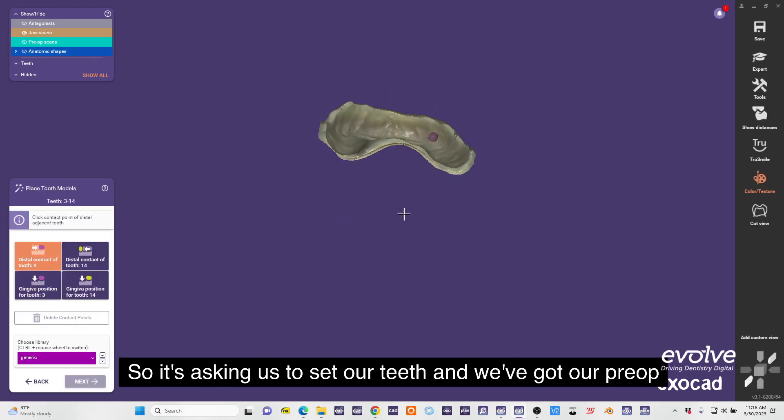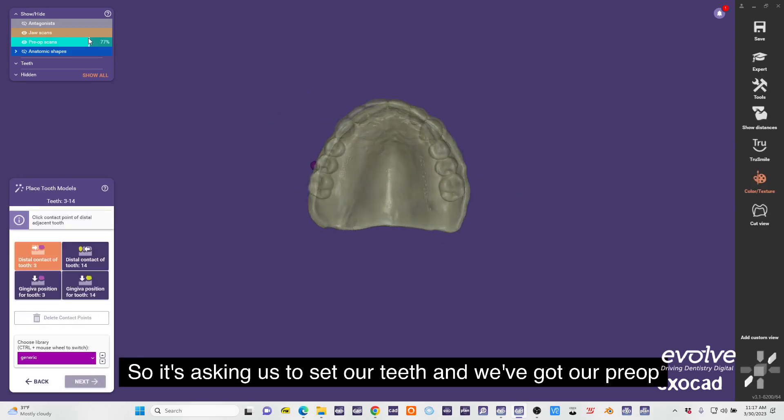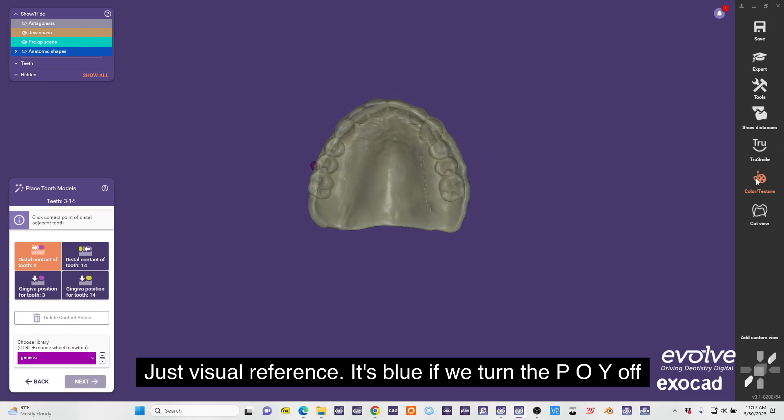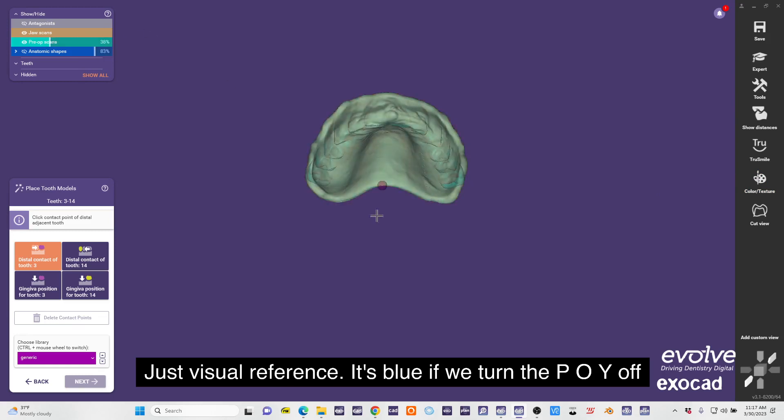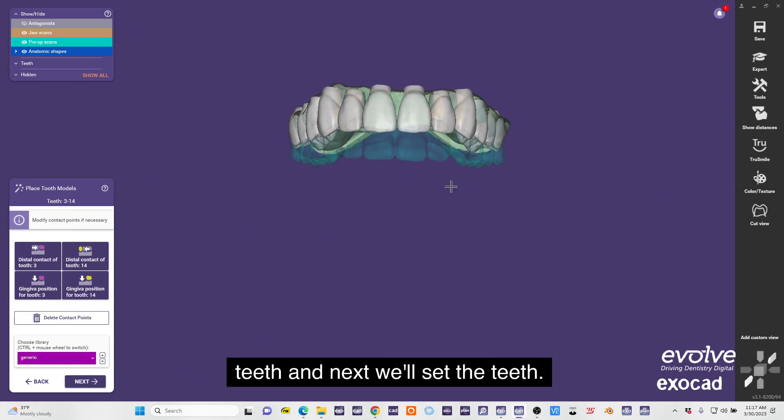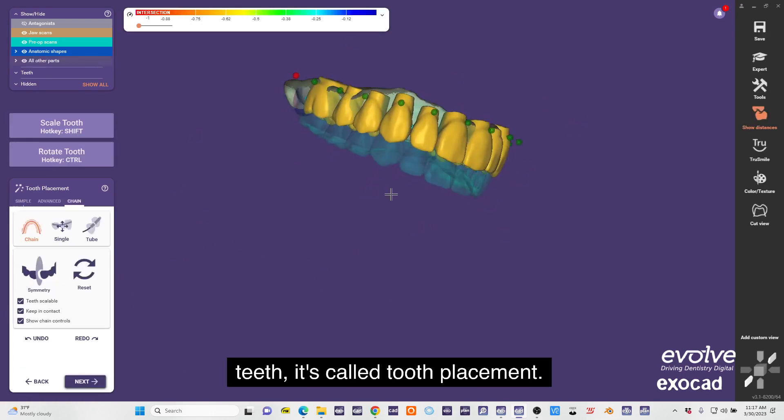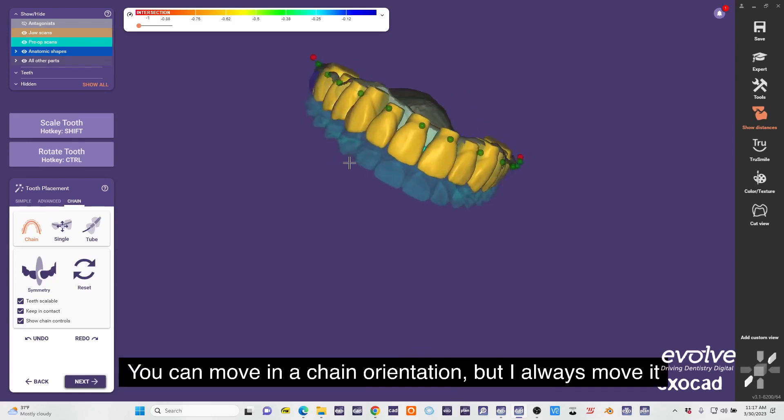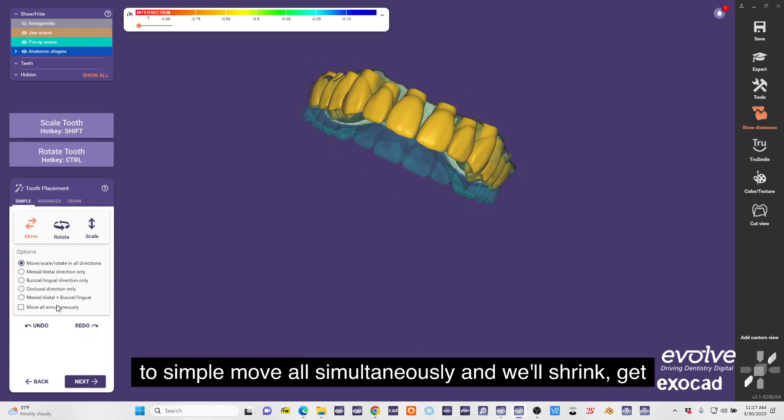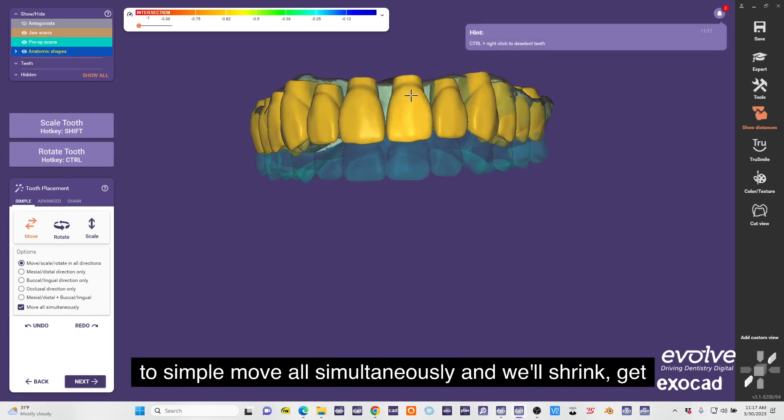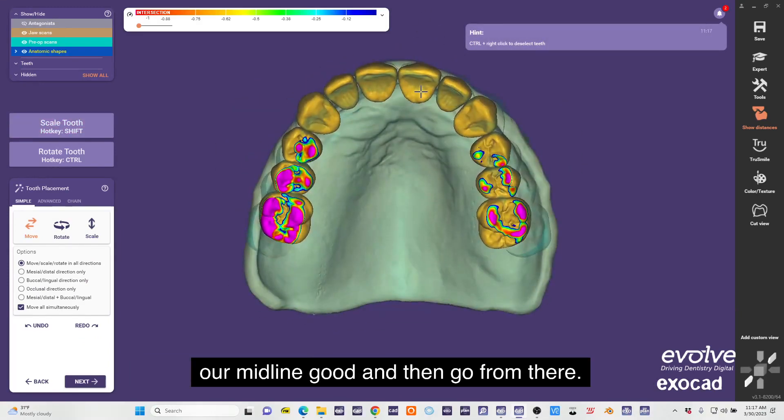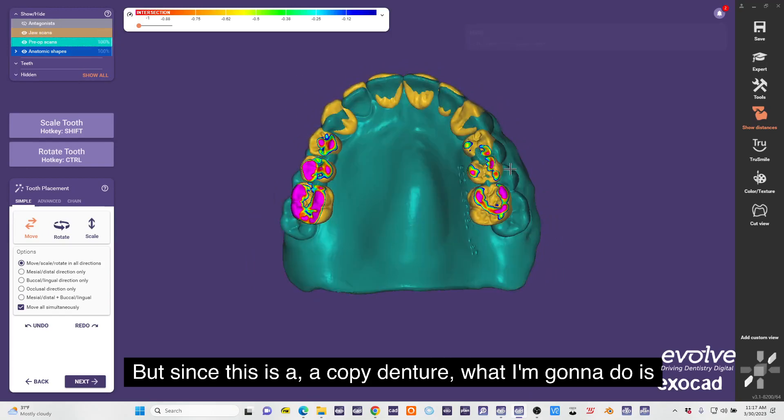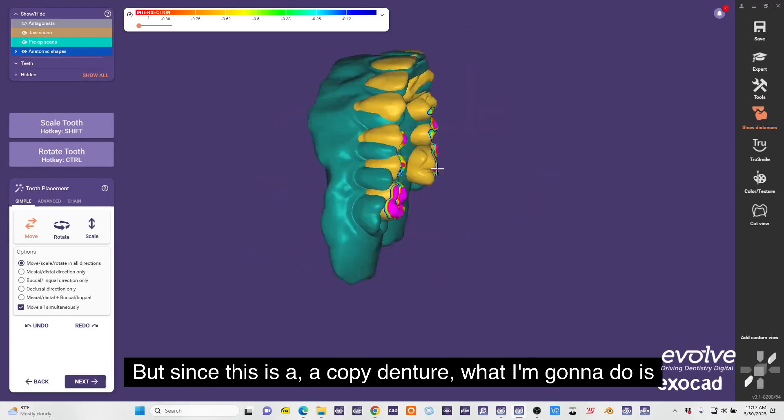It's asking us to set our teeth and we've got our pre-op just right here, just visual reference. It's blue if we turn the pre-op off. We can just place teeth - this is just placing the teeth. Next we'll set the teeth. Here's where we're setting teeth, it's called tooth placement. It takes you right into chain mode. You can move it in a chain orientation but I always move this simple move all simultaneously. We'll shrink, get our midline good, and then go from there.